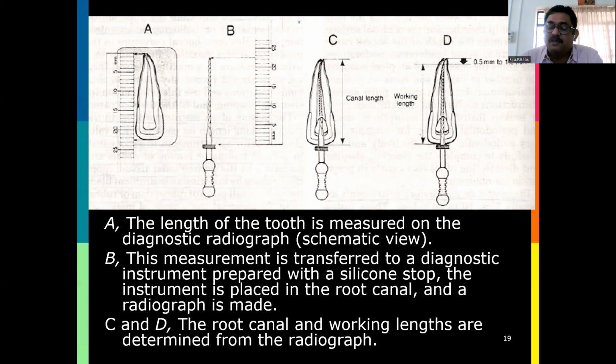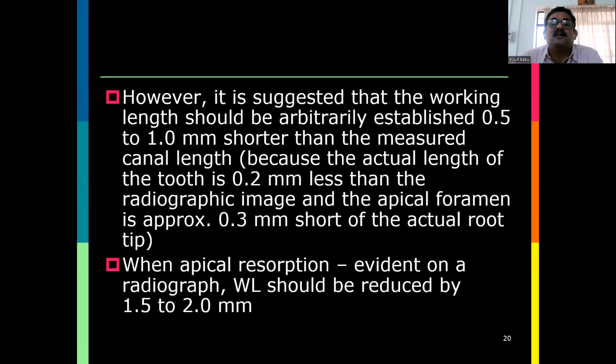This was a formula method used earlier, but it gives you results somewhat close to accurate. But now you have better working length determination methods.